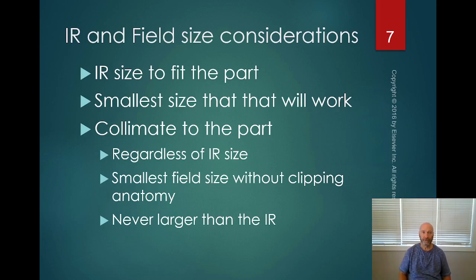Now, there's one other consideration, and that is that sometimes you may need an image receptor size that's actually a little bit larger than your anatomy size. Because we create x-rays, and x-rays come from a point source on the anode, and they spread out isotropically, but we limit the beam to an area beam, then what we have is a beam that's kind of pyramidical in shape.